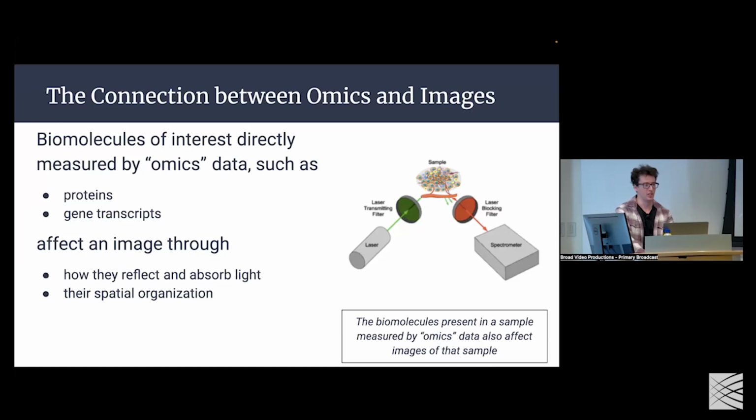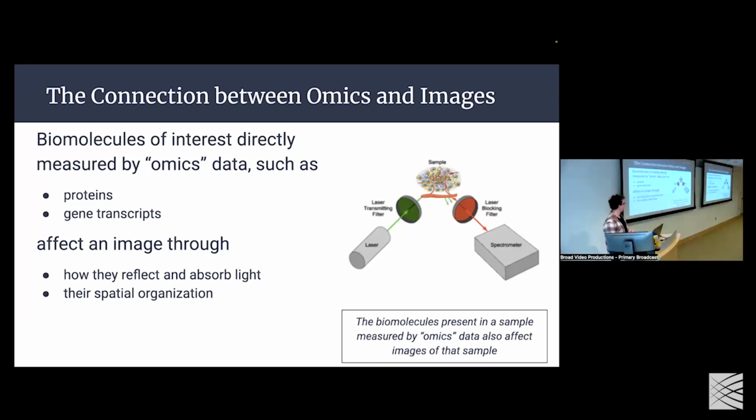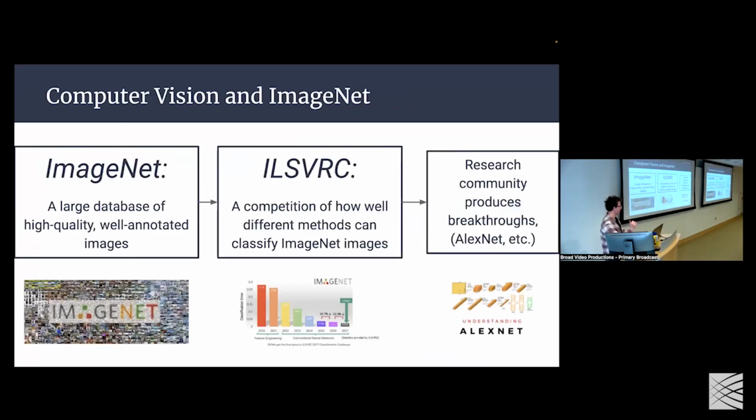With this being said, as with anything in data-driven sciences or machine learning, we have to look at what the connection is between these two. We'd like to think that there is a shared signal between a tissue's imaging data and its omics data. Intuitively, biomolecules of interest manifest different phenotypes of the tissue, like what the pathology looks like, or what different intensities at different points of the images look like. Because of that shared signal, we can ask whether we can use data-driven models to connect the two, and by connect, I mean move from one to the other.